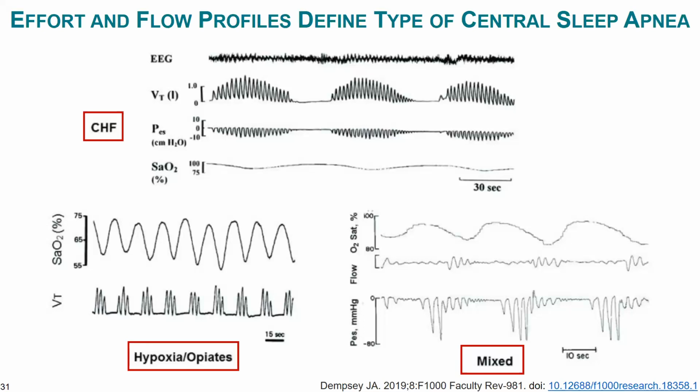And you see the symmetry here in oximetry, you see the symmetry in the ventilation, but you see it, for that matter, in pulse rate and any other cardiorespiratory signal. The challenge here comes in the lower right-hand panel, where you see a mixed event, a central apnea component, followed by a few obstructed breaths. And the presence of those obstructive breaths leads to the ventilatory overshoot and an asymmetric pattern. And so generally speaking, obstructive episodes and mixed episodes lead to the abrupt resaturation compared to the preceding desaturation.